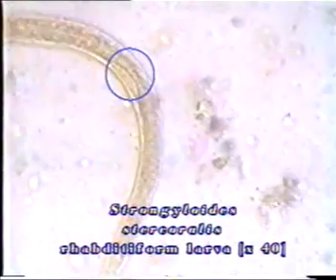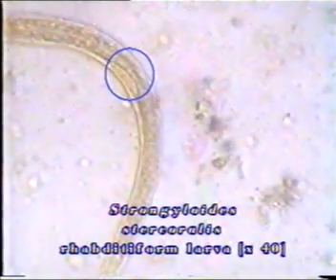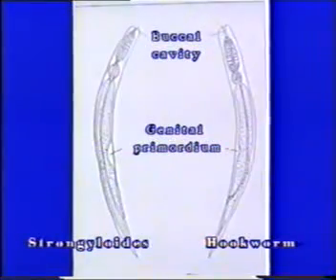In Strongyloides infections, rhabditiform larvae appear in faeces. In fresh preparations, the larva is actively motile, moving rapidly. It measures around 225 by 16 micrometers. The larva is identified by two characteristic morphological features: the buccal cavity, which is shorter than the width of the head, and the genital primordium, seen near the middle of the larva. In old fecal samples, rhabditiform larvae of hookworms may also be found. These are also motile but can be differentiated by their longer buccal cavity and indistinct genital primordium.